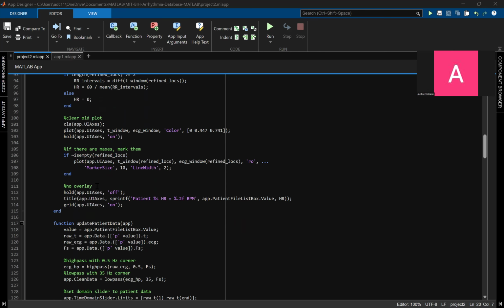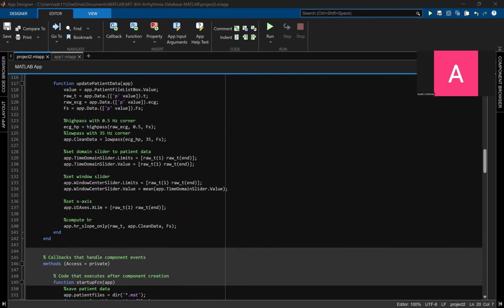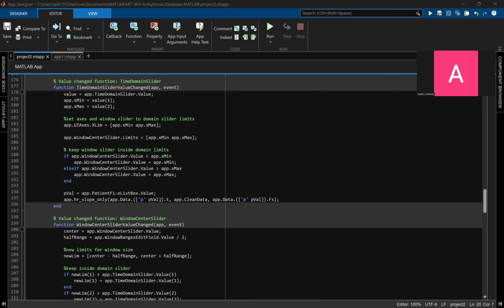And then plotting them is a whole other thing. It's easy. And then updating the patient data, which is just putting it through filters and setting the domain sliders or the slider values. And all of that's just implemented in here within the value change functions.